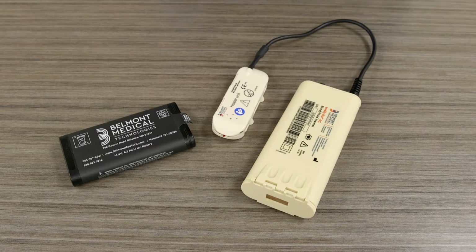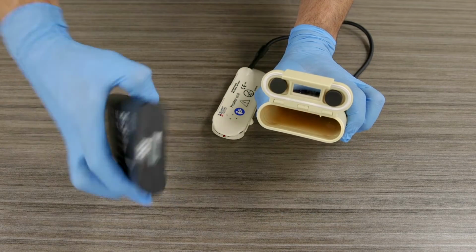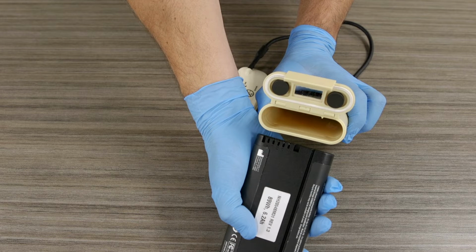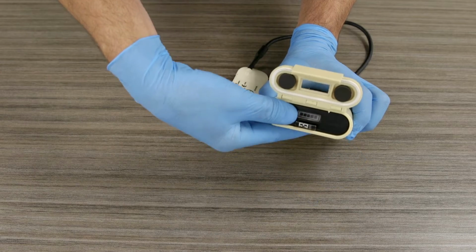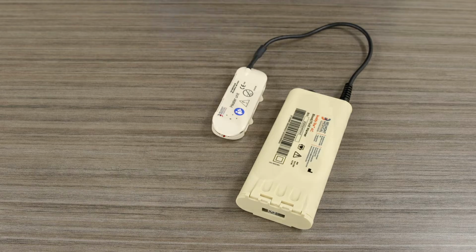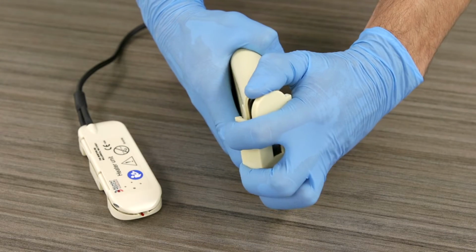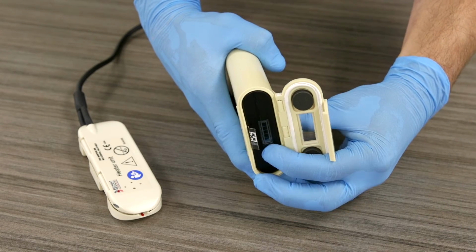To load the battery, unlatch the battery housing door located on the top of the battery pack. Insert the battery into the housing with the LCD panel positioned towards you and the notch in the battery housing lined up with the groove in the battery. The battery must be oriented so that the pin connections on the battery make contact with the connections located inside the device. Once the battery is seated, close and latch the door. If the door will not close or latch, be sure that the battery is fully seated in the correct position.